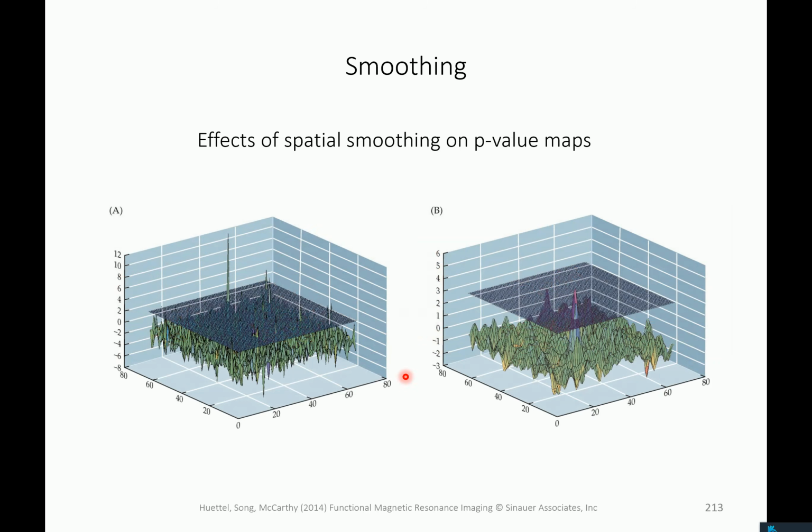And then there's the story about random field theory and smoothing. The random field theory based p-values need a measure of smoothness. The p-values that you assign to peaks depend on the smoothness of the data, which is estimated from the data, and have been shown in some Worsley publications from the 90s to do specifically well if there's a given smoothness.